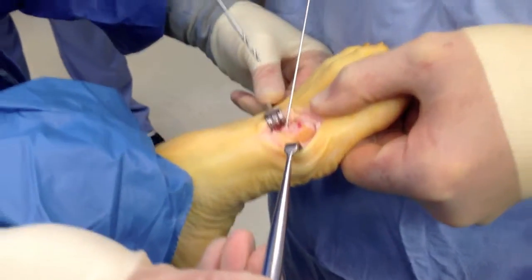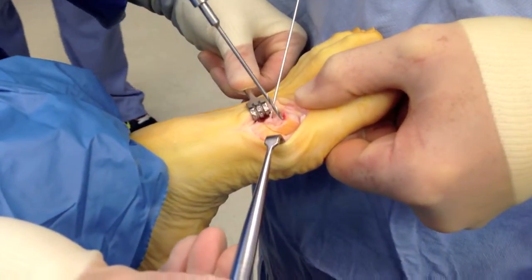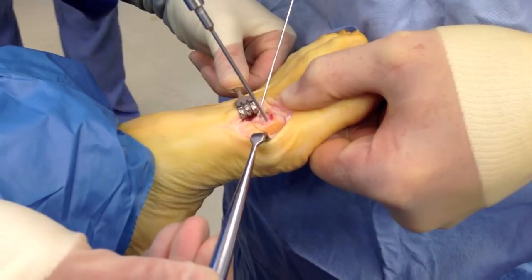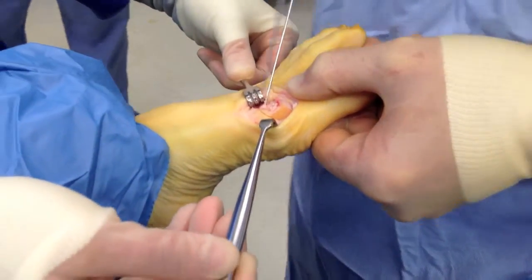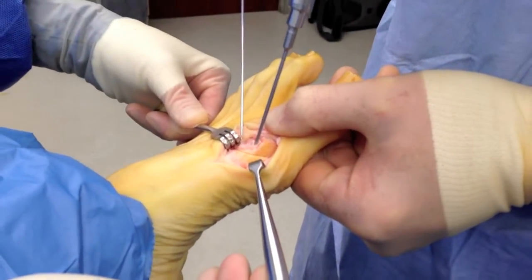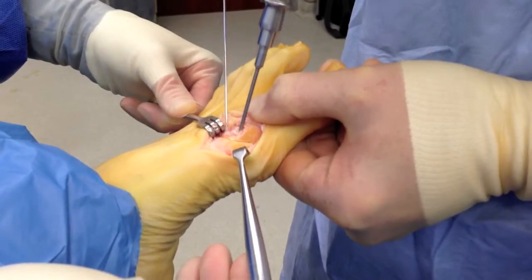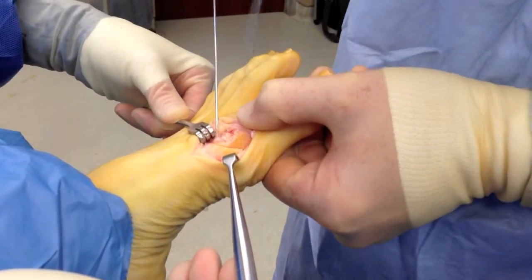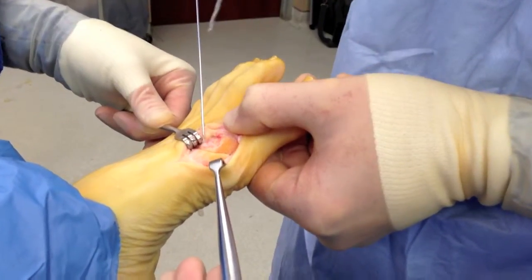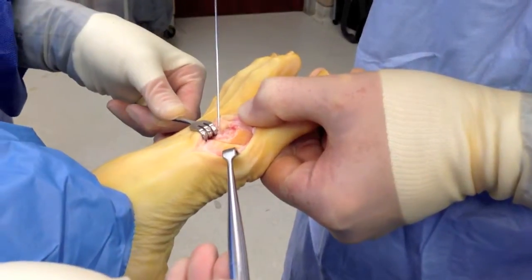Now we're going to drill the portals. I like to start perpendicular because the drill bit wanders. Then I'll redirect and drop my hand so I catch both the top cortex and the bottom cortex of the metatarsal shaft. Ream it a couple of times — that's really important — so the allograft slips right in and out and does not get hung up.